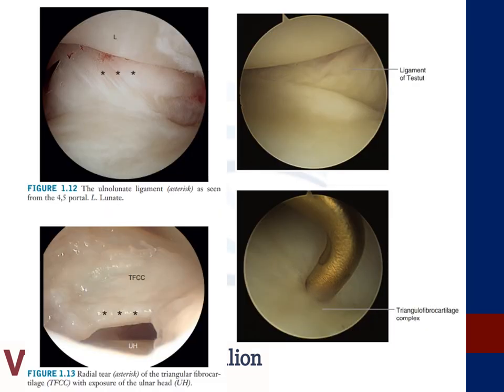These images demonstrate anatomic structures visible through the 4-5 portal as we progress ulnarly across the wrist joint. The top right image demonstrates the ligament of Testut, otherwise known as the radioscapholunate ligament, with red discoloration at its distal aspect representing blending with the SL interosseous ligament. The top left represents the ulnolunate ligament, and the bottom images are representations of the TFCC, with the bottom left image representing a tear exposing the underlying ulnar head.